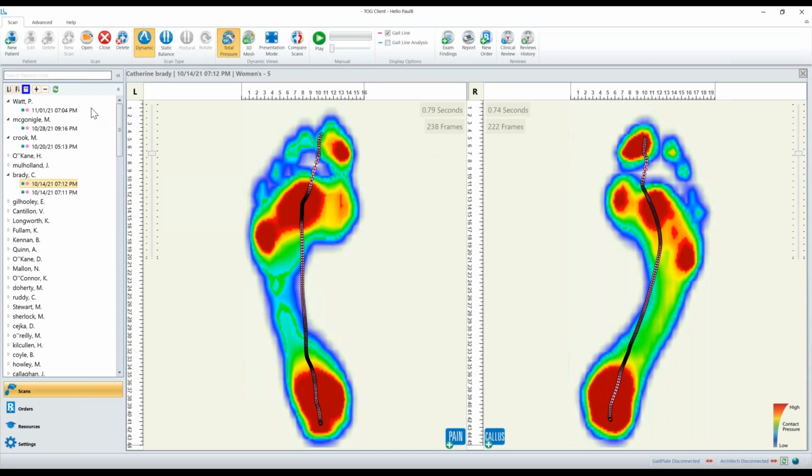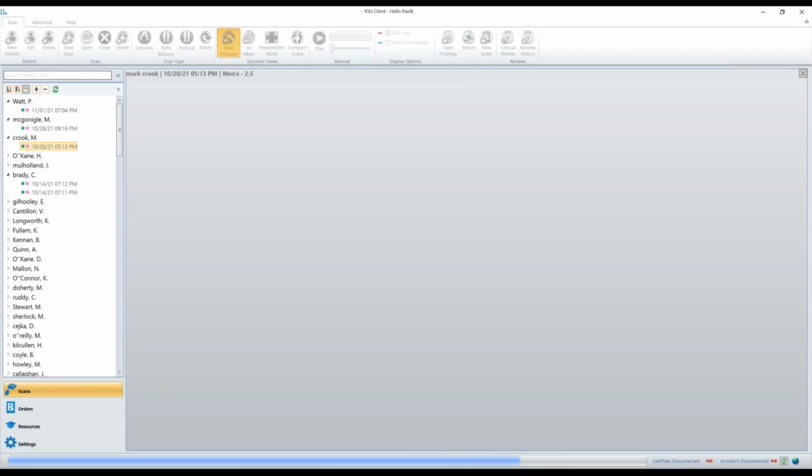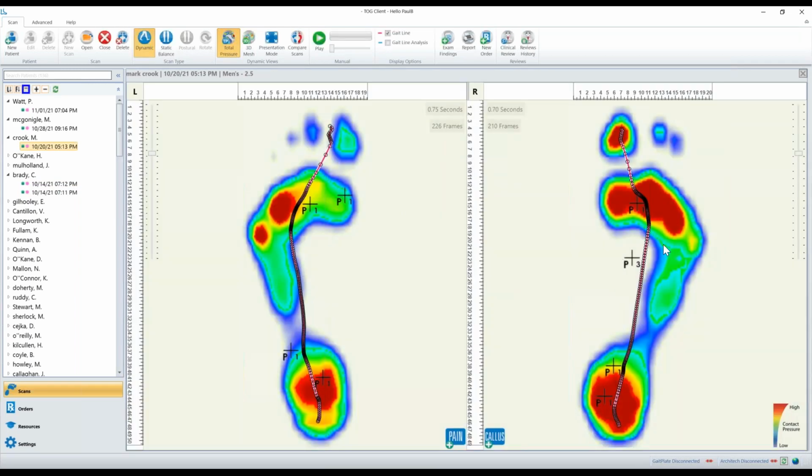And again, what we had with this patient was asymmetry. We have the right foot which wants to roll in, and the left foot which wants to roll out. So on this occasion, we're going to have the ASIS pushed forward on the right side and pushed posterior on the left side. And again, that's a flag.